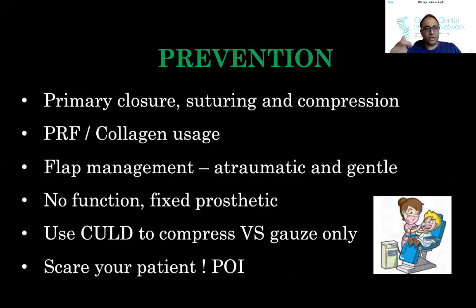Primary closure, suture, and compression. You can use PRF. It also helps to initiate the fibrin clot or collagen. And again, you want to manage the flap, right? If you have a nice clean flap and you're atraumatic and you put it back, then it'll heal properly, with less chance of having this issue. Okay, if you can have a fixed prosthetic go on top, that's the best Band-Aid. But make sure that you have some compression.